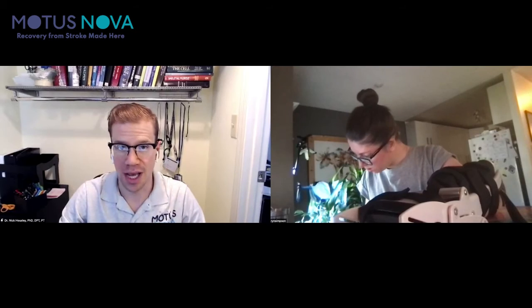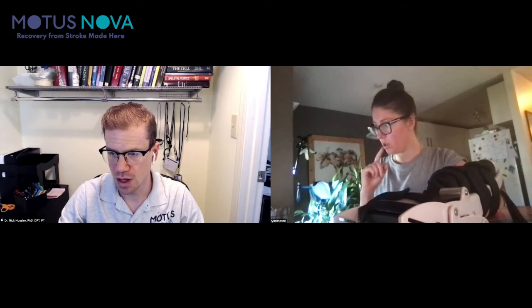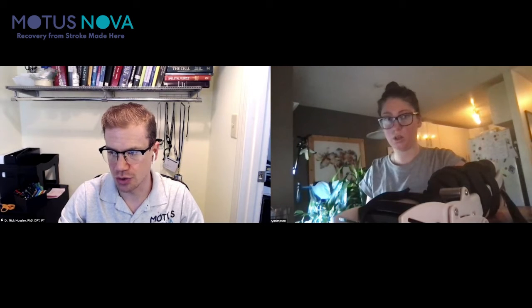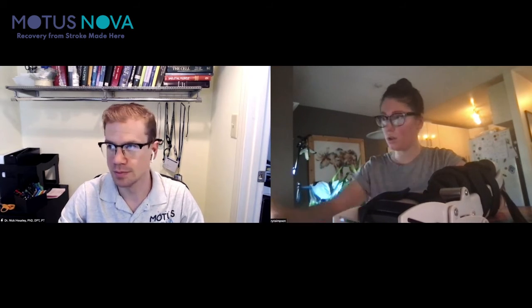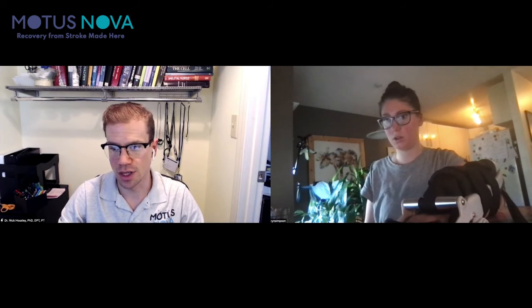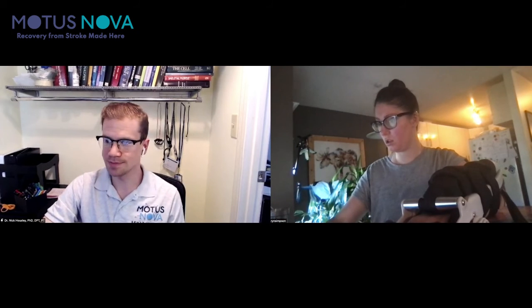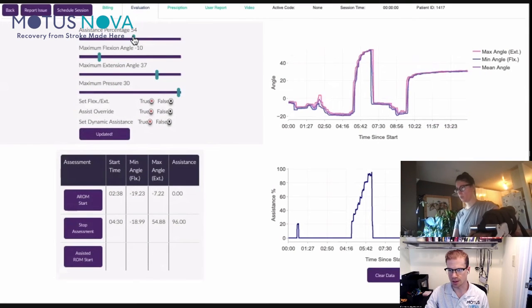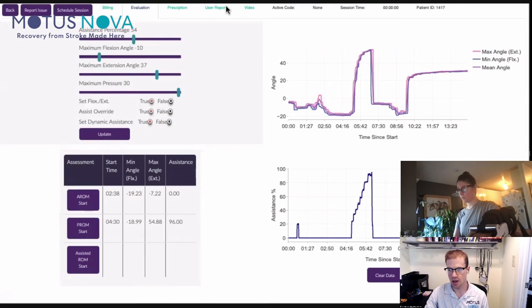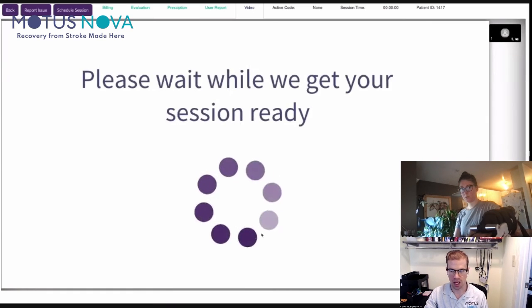But let's go ahead and do this actually, Catherine. I would very much like you to go into your activities really quickly. And we can actually go through, let's see here. So I'd like you to hit the back button and go ahead and hit home. And I'd like you to actually start playing some of those exercises. And then I can watch some of the data come in and we can make sure that it's working for you. And while we do this, I'm actually going to go over to my next guest with Renee.